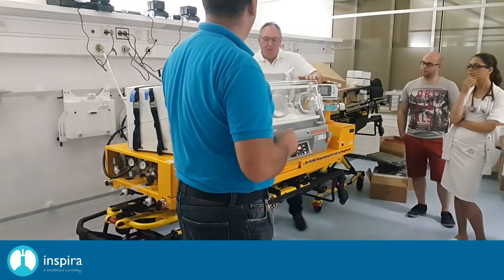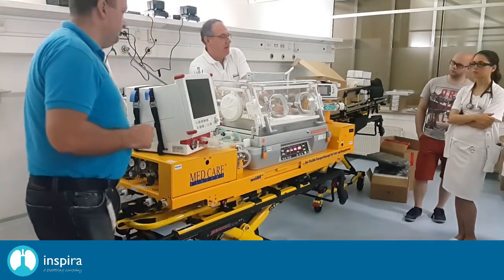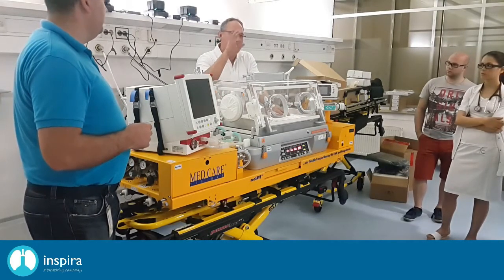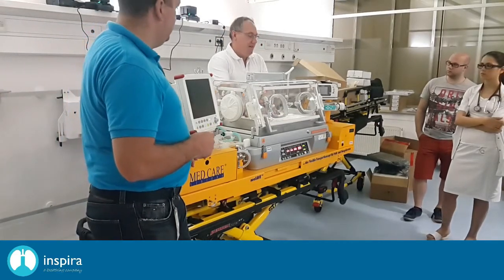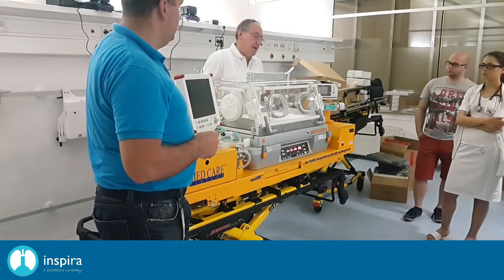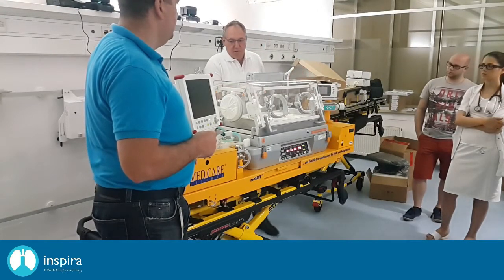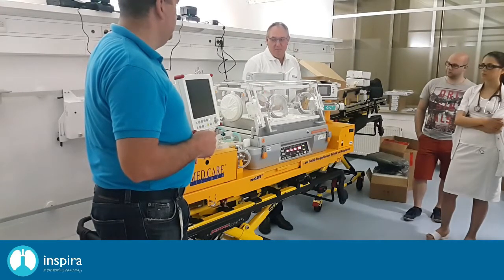And it's also important that you avoid putting any things left and right of these corners, okay? If you put diapers or some nice sweet little pads or something inside here, you get an overheating alarm immediately, okay? And this is also an alarm which you can only switch off by switching off the main switch, okay? Very important, because this is really getting on the nerves. This alarm is present. Okay?